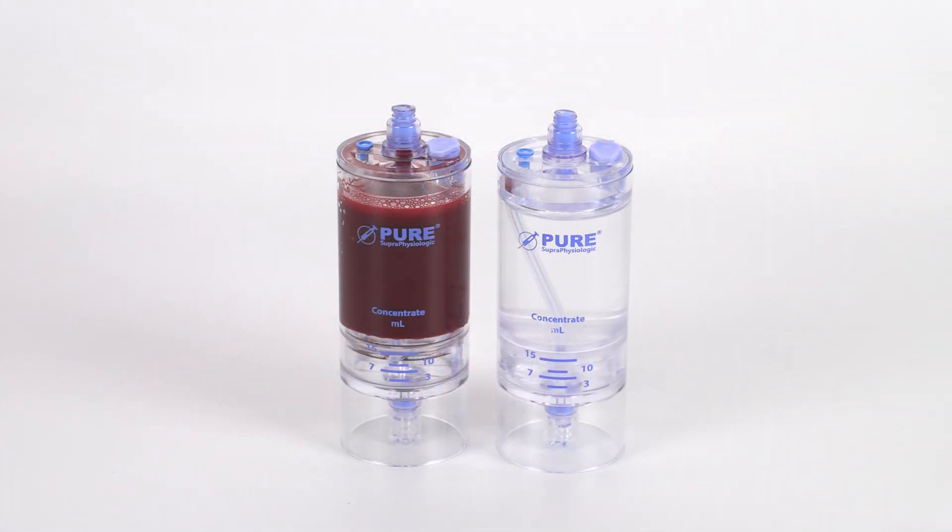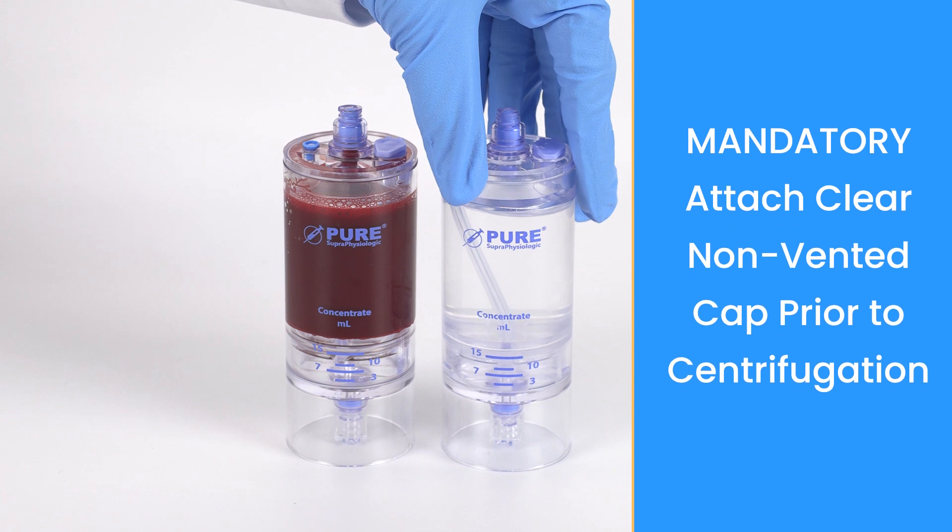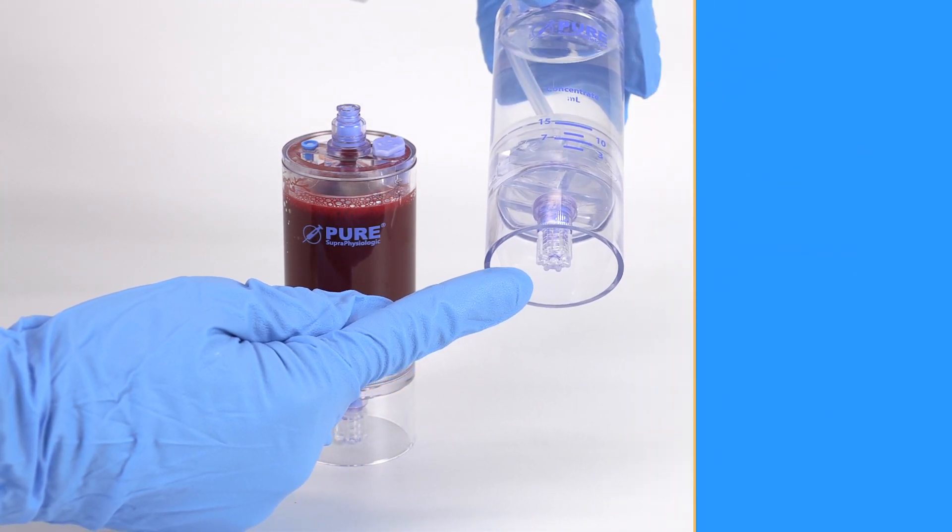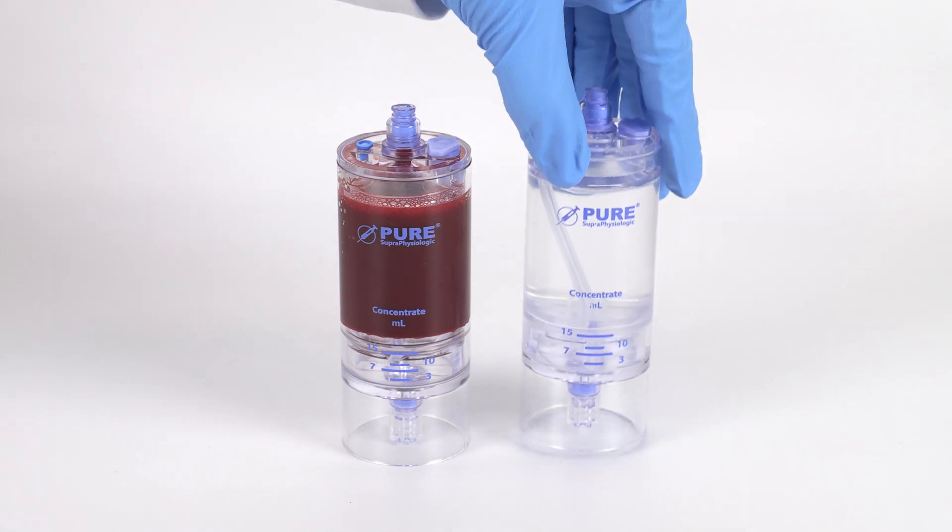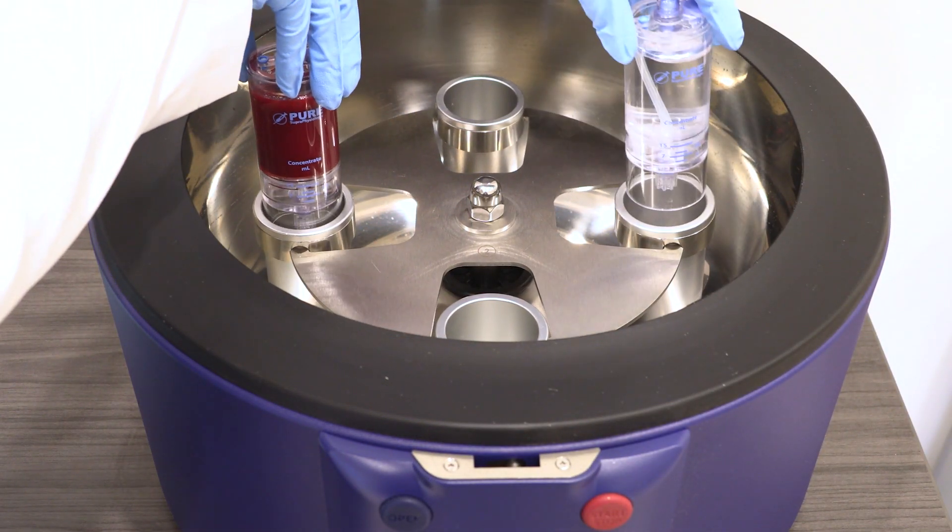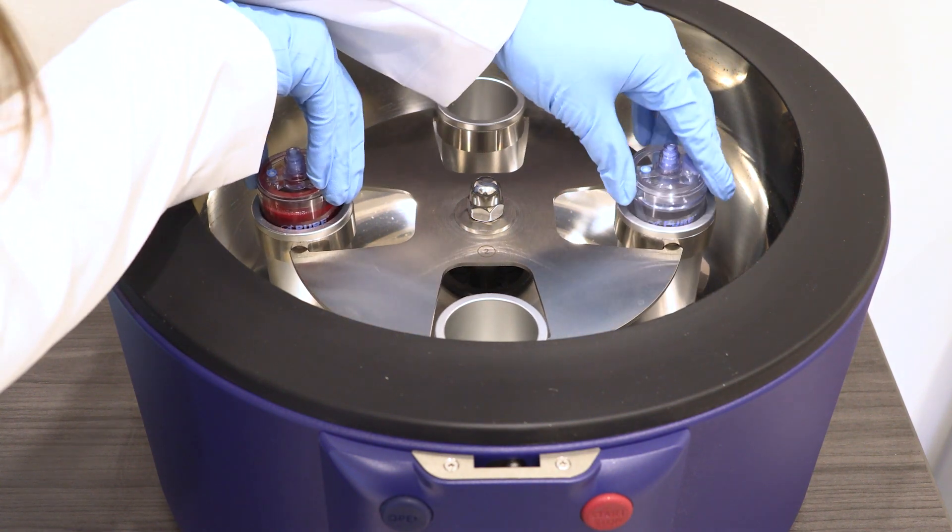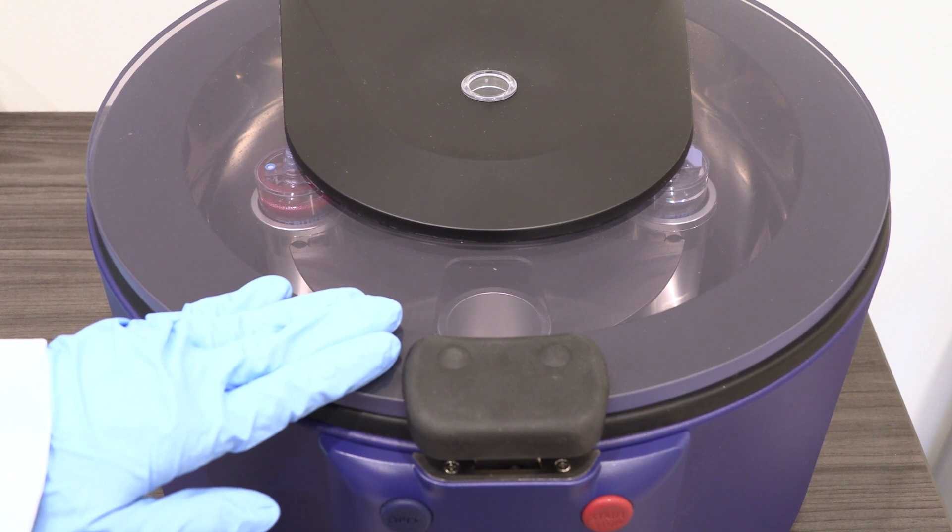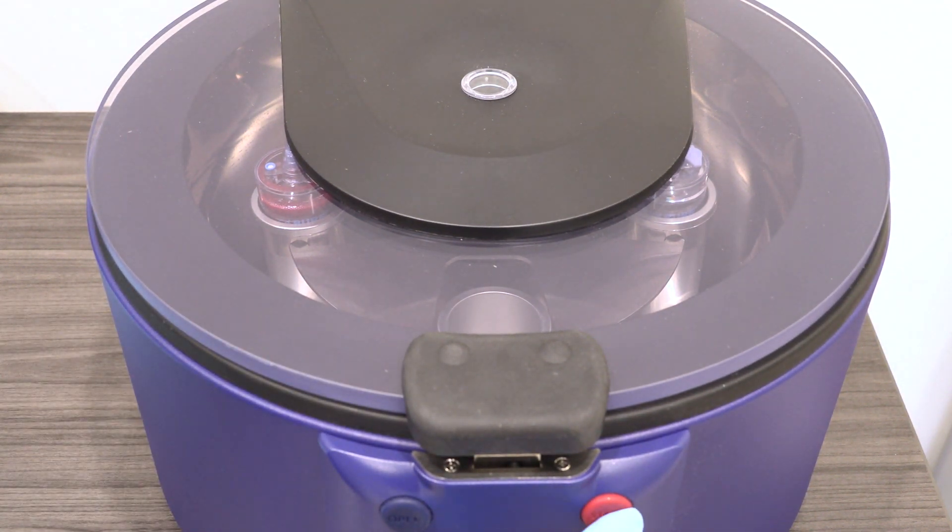Use the counterbalance device to counterbalance with equal volume. Be sure to always place the clear non-vented cap to the bottom port of the counterbalance device as well. Place both devices in the centrifuge rotor at opposite ends. Follow the protocol settings provided in the IFU insert. Close the centrifuge lid and press start.